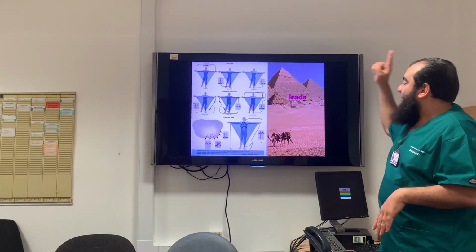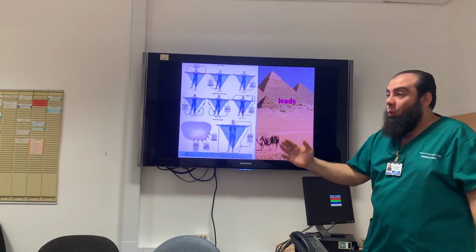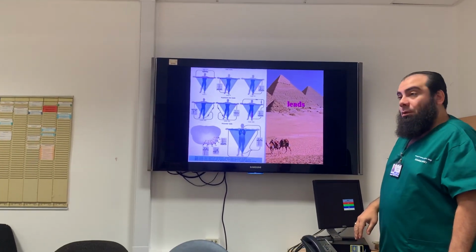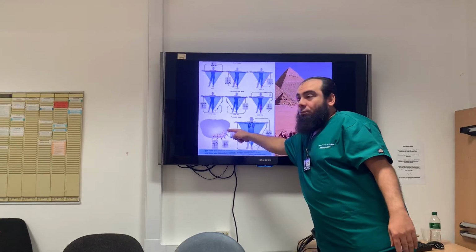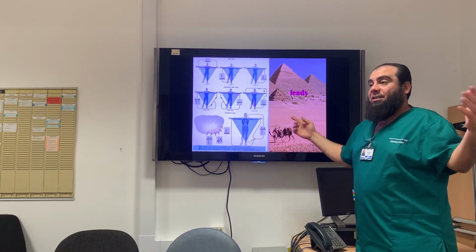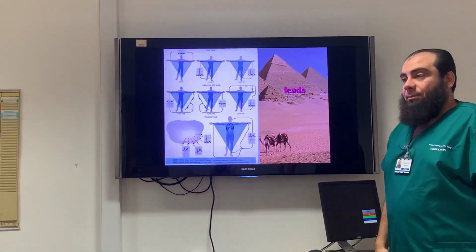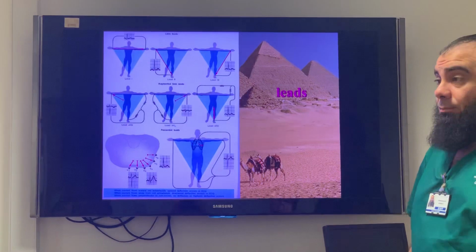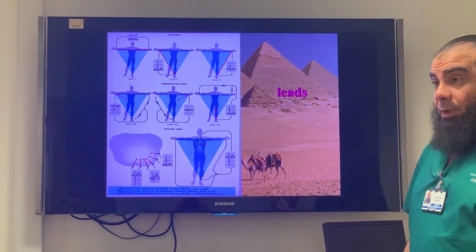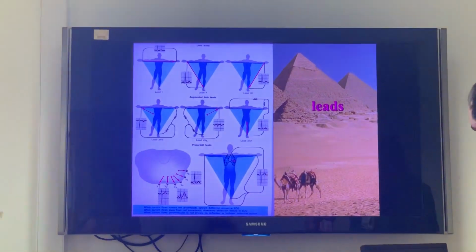Obviously, we attach 6 here around the chest, and we'll explain how and where later on. The other 4 are on the extremities: right and left shoulder, and right and left lower limbs, or hip, whatever. I might need that picture later on, I might come back to it, okay?